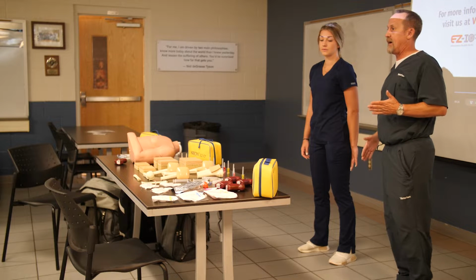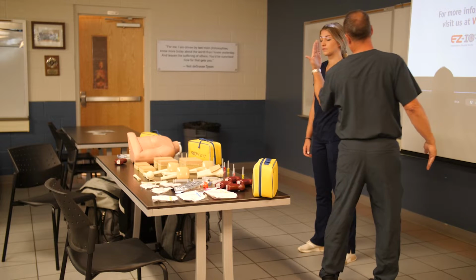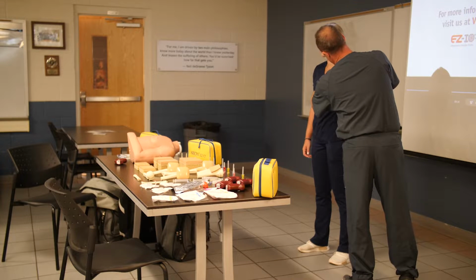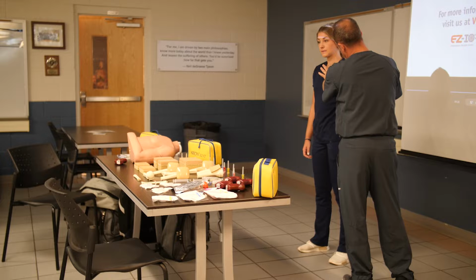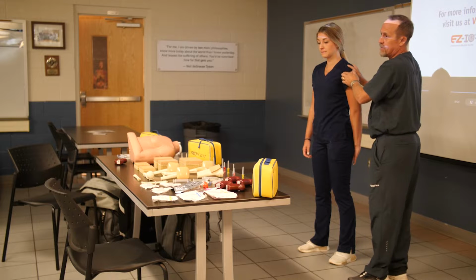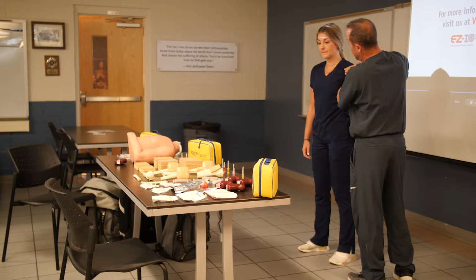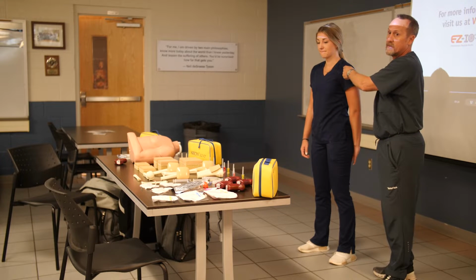Another way that you can identify that area, and I always talk about using your karate chops. So we're gonna have our hands like this. I'm gonna take one hand and just put it right in her axilla, okay? I'm gonna take my other hand and put it right at the midline of her humerus. And now I can bring my two thumbs together like a triangle and drop them straight in. And you guys will notice that puts my thumbs just right in line with where her humerus is. And now I can start palpating up until I feel a notch right here. It's kind of a step up. It feels like a golf ball sitting on a tee. Once I identify that, that's right where the surgical neck and the humeral head come together. I can actually landmark about 2 centimeters proximal to that, and it's gonna take me right to that same location.